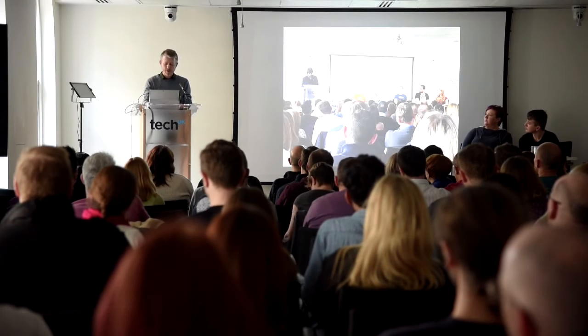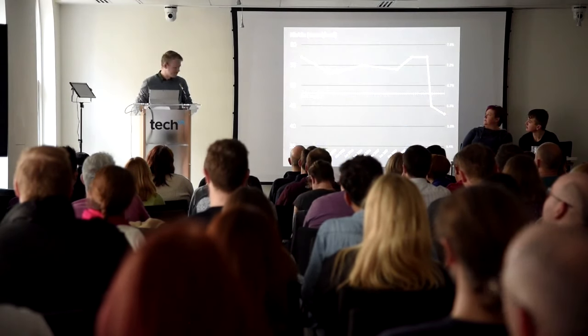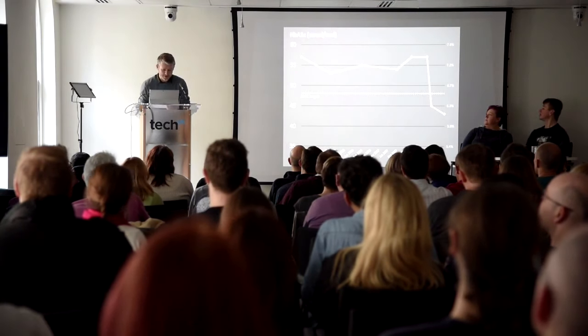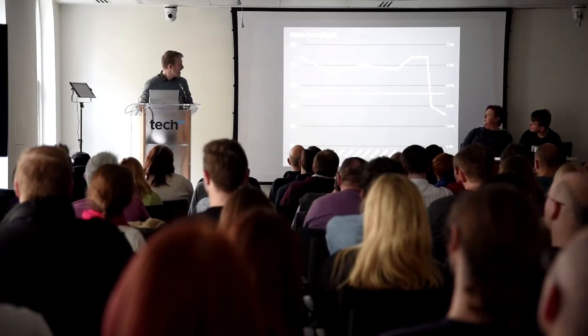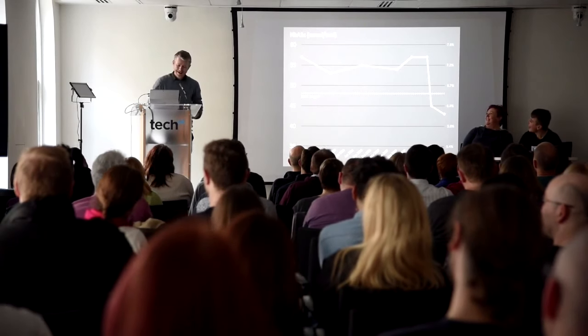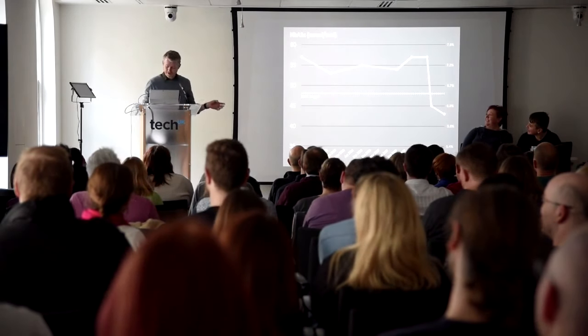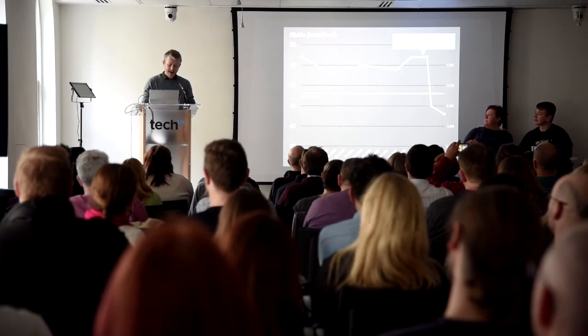This feels like a good moment to show you what happened next in the form of a graph of my HbA1c results over the last few years. This goes back to 2014, so it's 4 or 5 years of results. Would anyone like to try and guess when I switched on Android APS? In case it's not obvious, I got my NHS Dana RS pump in June and started looping.